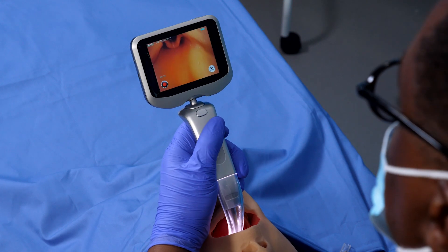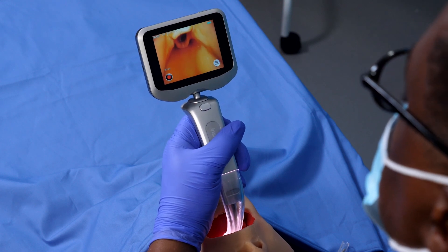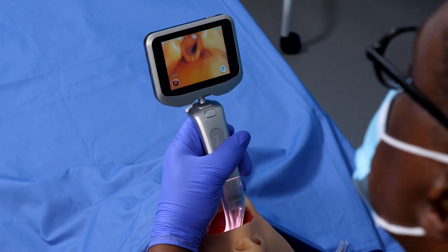Once it's past the root of the tongue, look at the video laryngoscope screen and locate the epiglottis. Insert the tip of the laryngoscope into the vallecula epiglottica, then lift the epiglottis gently to view the glottis.